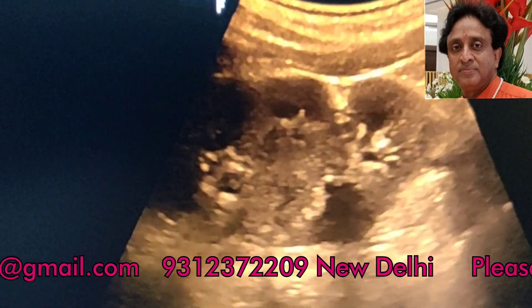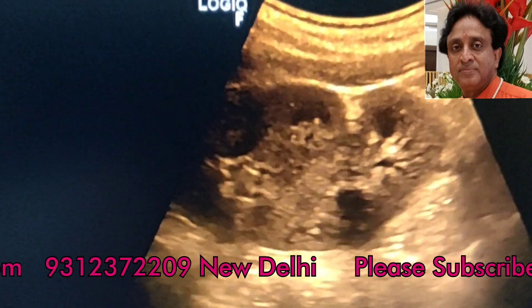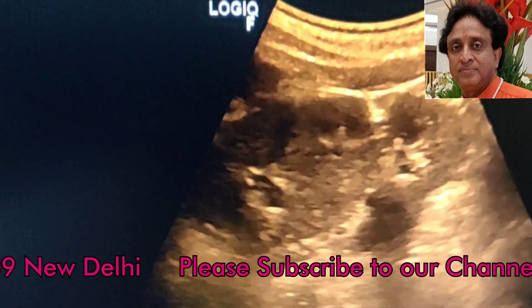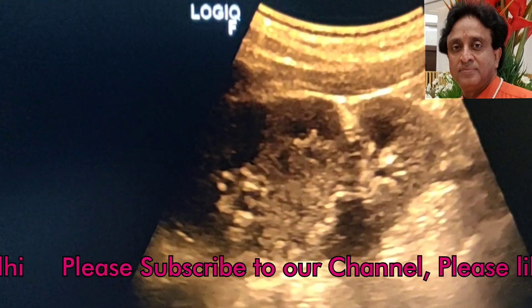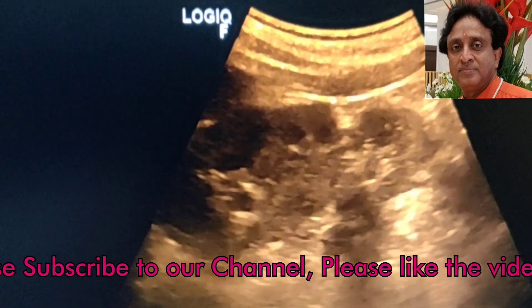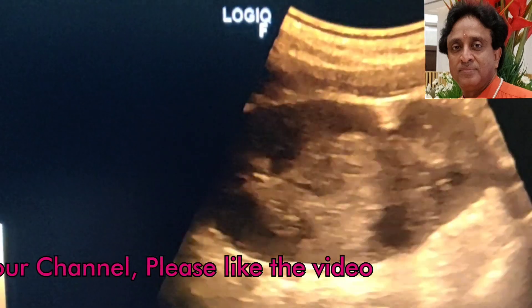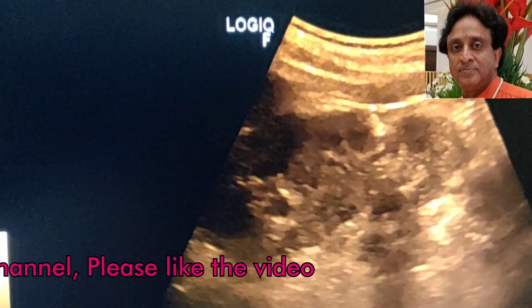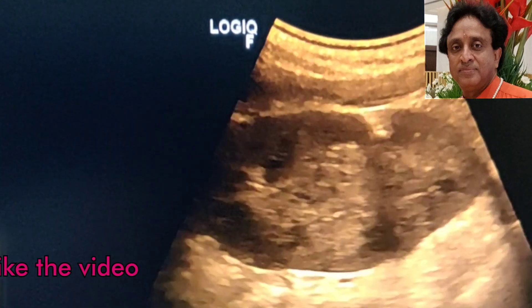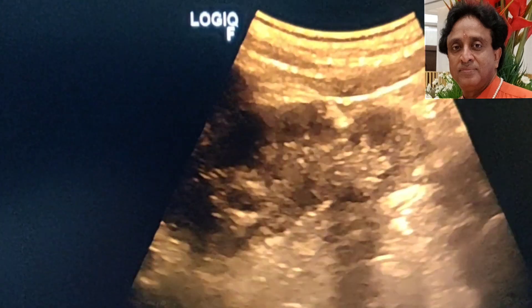The ultrasound examination is highly suggestive that we are dealing with a case of supernumerary kidney: it is on the left hand side, it is an incidental finding, the left main kidney has its own separate capsule, the supernumerary kidney is fused with the left main kidney at a perpendicular axis, and both seem to have separate blood supply.